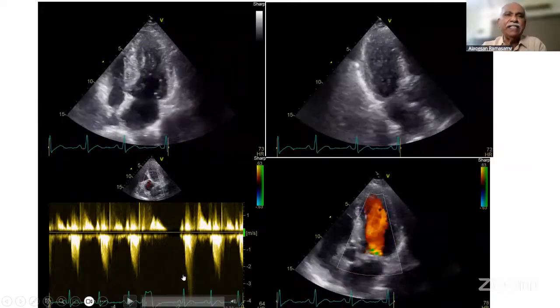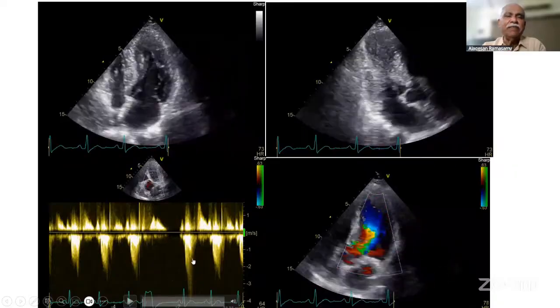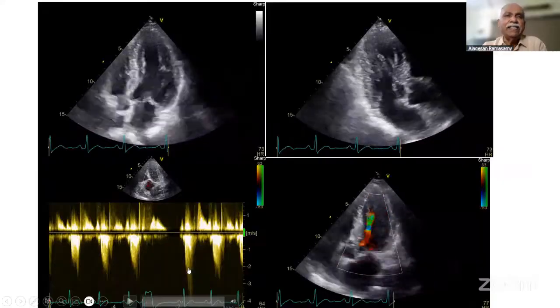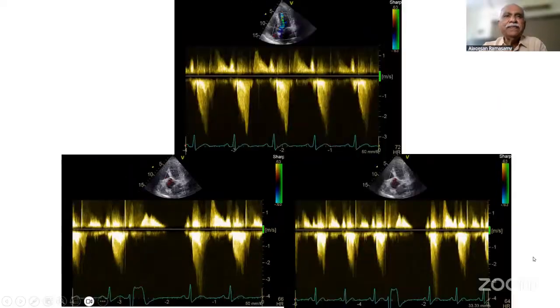This again indicates that the patient has got latent left ventricular outflow obstruction. This is the Brockenbrough-Braunwald phenomenon, which has been described in the cardiac cath. It is the equivalent in the Doppler. So this again shows the same findings, the gradient increasing after an ectopic beat.